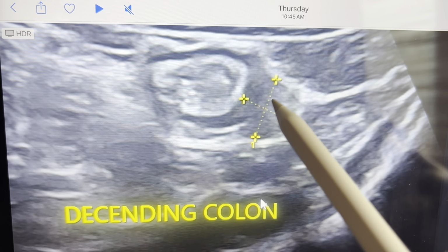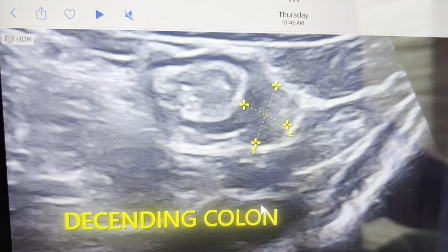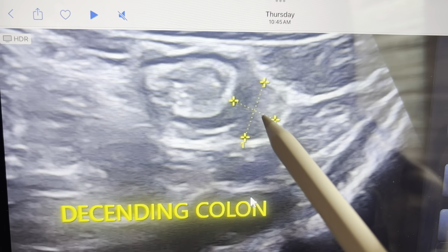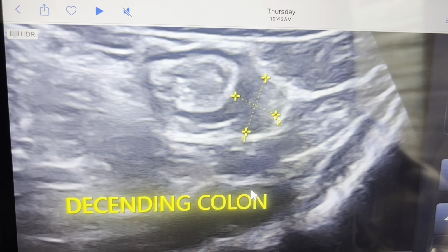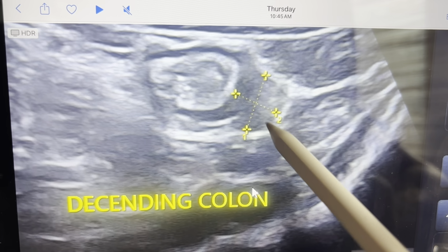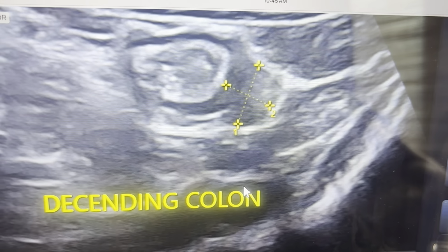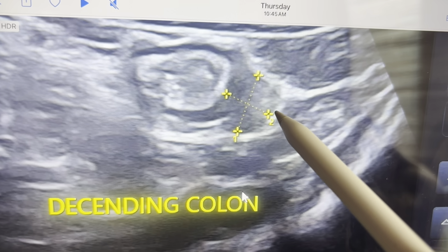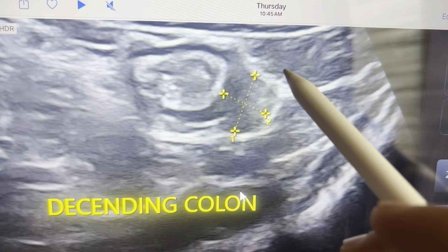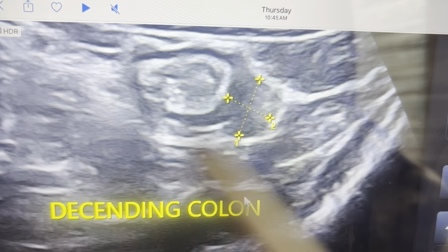So this is the milder form of epiploic appendicitis, and when this fat globule becomes more inflamed, then we sometimes see an internal cystic collection inside this fat-filled pouch, and surrounding soft tissue inflammation also, with fat stranding in the periphery of this epiploic appendage.